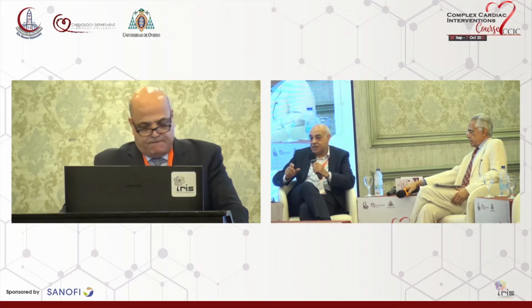IVUS could be a very helpful tool in this condition. Multiple imaging and multiple ways of assessment of the lesion is important in this situation, I think. The IVUS plus the IFR is very significant. I appreciate what you did. It's an excellent result and an excellent demonstration of the crush, which is a very important way to treat bifurcation lesions, especially in the left main, and as demonstrated by the results of the studies, it gives lower target vessel revascularization, especially in the ostium of the circumflex.